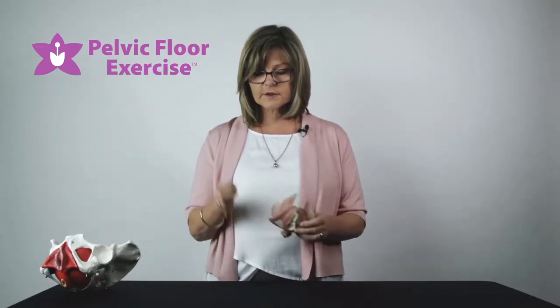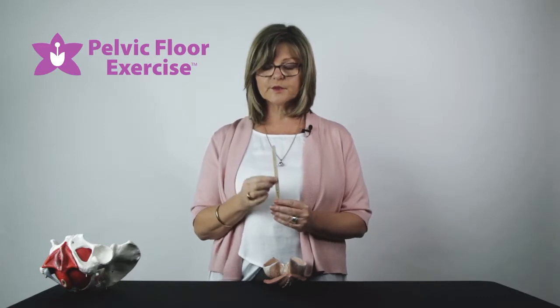So as one of our measurements in the clinic, we will often use the popstick, which is also used to do a prolapse staging measurement by gynaecologists and physiotherapists.